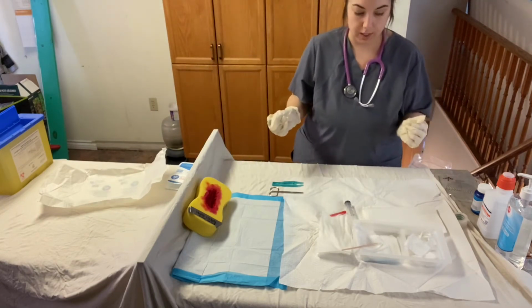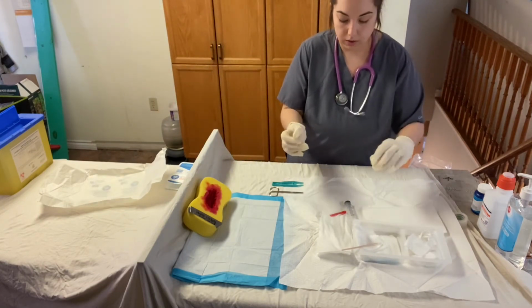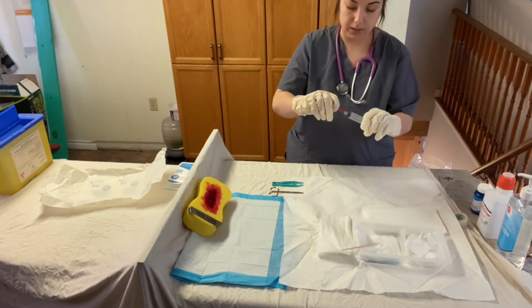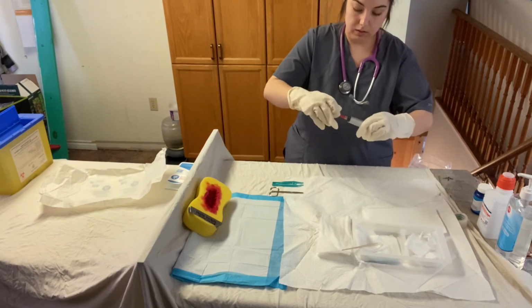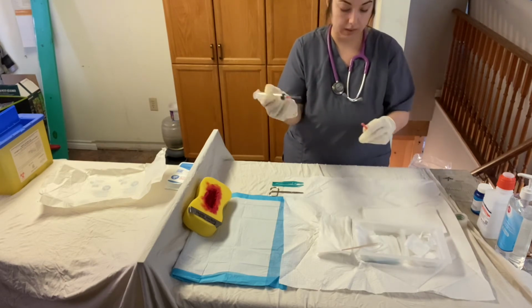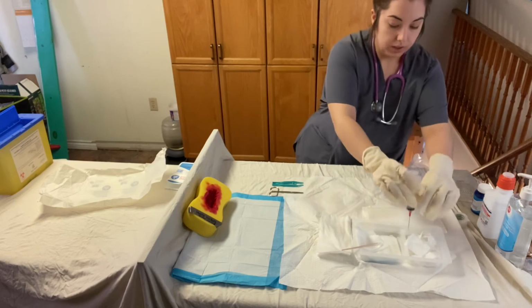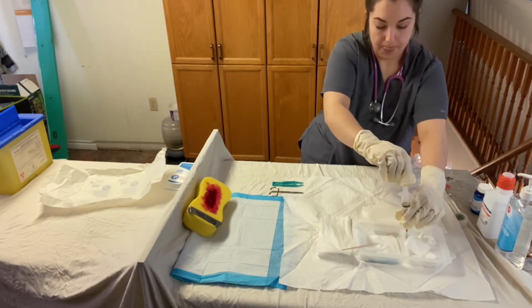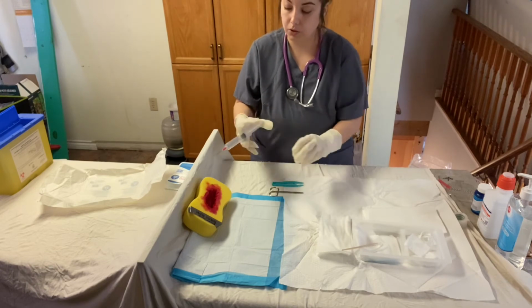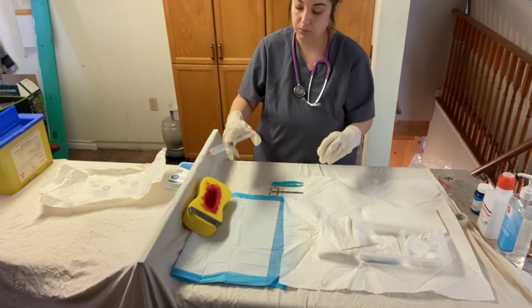I'm going to go over here and begin my irrigation. So first thing I'm going to do is grab my syringe, and I'm going to grab the blunt tip. I'm going to attach it to my needle, and then I'm going to fill it with normal saline. I'm going to irrigate the wound. What I'm going to do is do a zigzag motion from top to bottom.